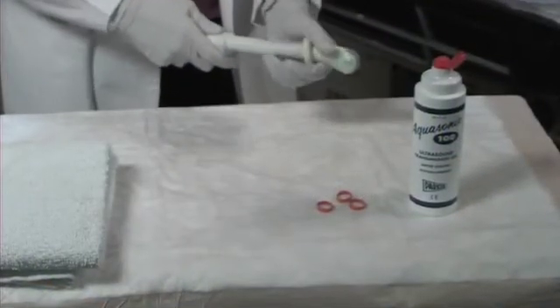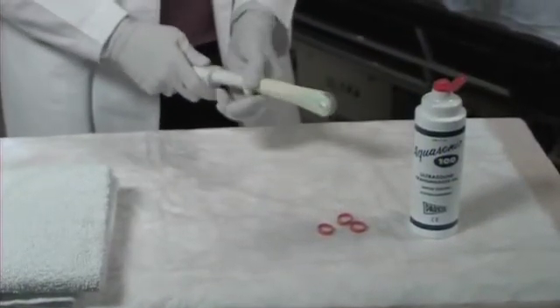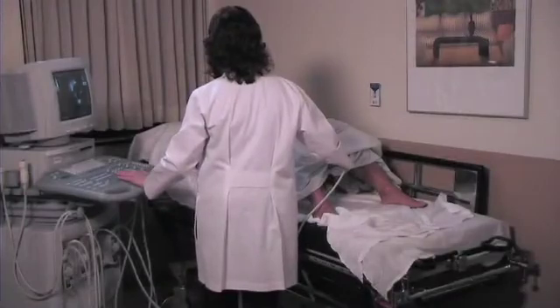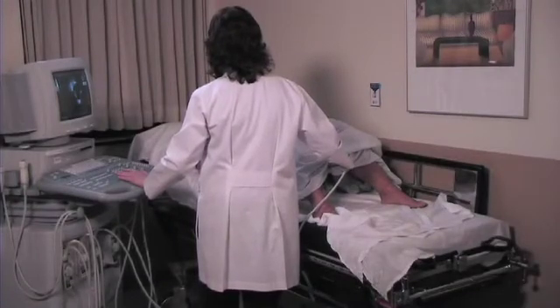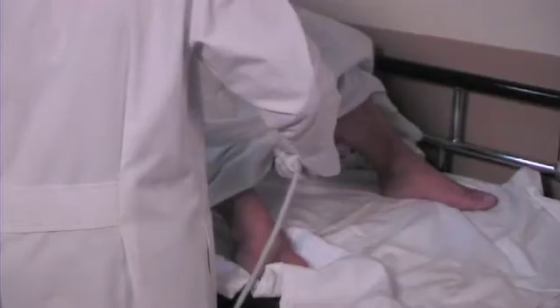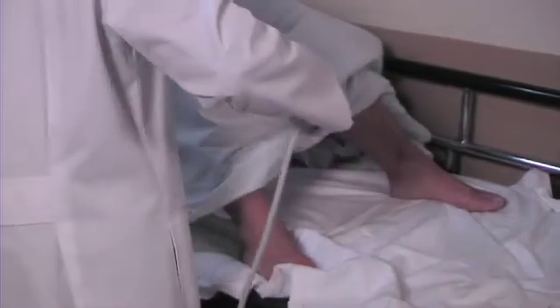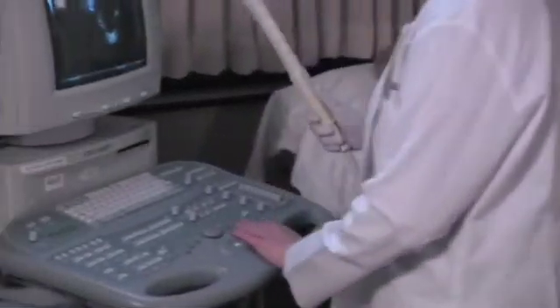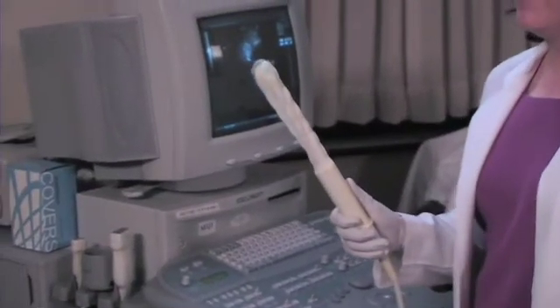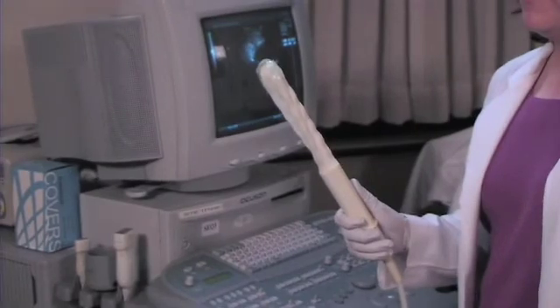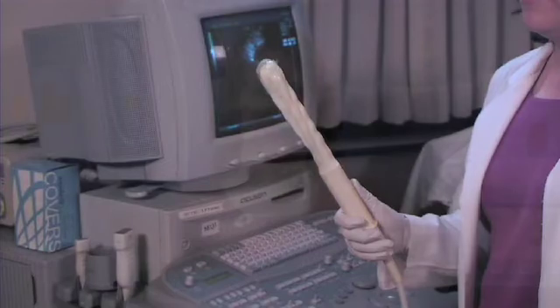Body orifices are not considered a sterile environment, so most transvaginal studies do not require the use of a sterile cover. The objective of the cover is to prevent gross contamination of the transducer with blood and or body fluids, and to prevent the transmission of disease to the next patient and the healthcare professional. Let's go through the steps to prepare a transvaginal transducer for endocavitary scanning.